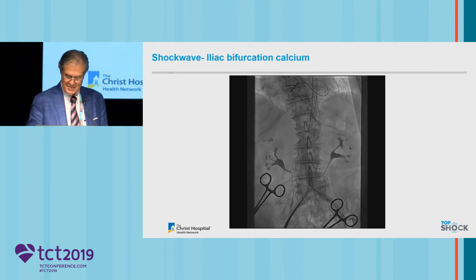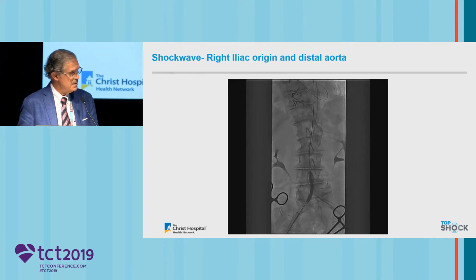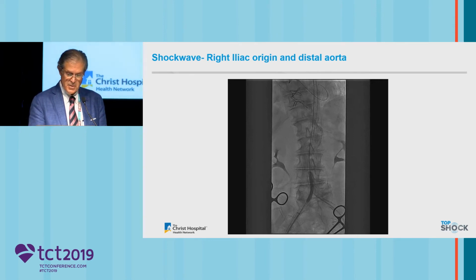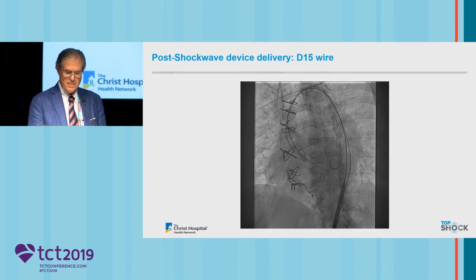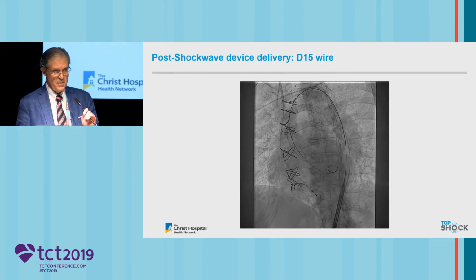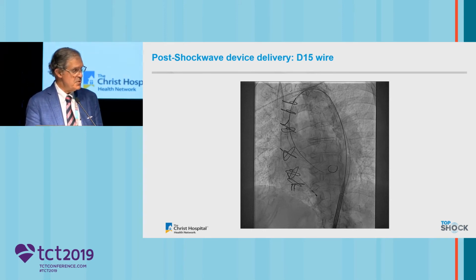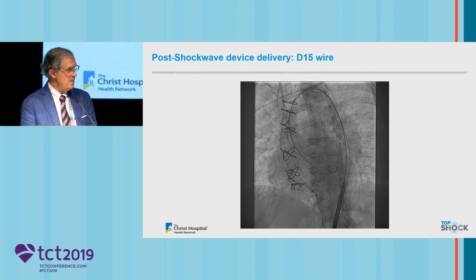I couldn't pass that up. So put a 14 wire adjacent to the Safari wire. This is the 7x60 balloon in the iliac and then in the aortoiliac junction. Traded the wire out for a D15 because, as you know, the Medtronic devices, despite the nose cone iterations, frankly track a D15 a lot better than a Safari through rough terrain. The case was closed after the procedure, home the next day, and I'm not making this up, granddaughter's wedding within a week. You know, this story could have been different for a frail 85-year-old lady with an alternative access.